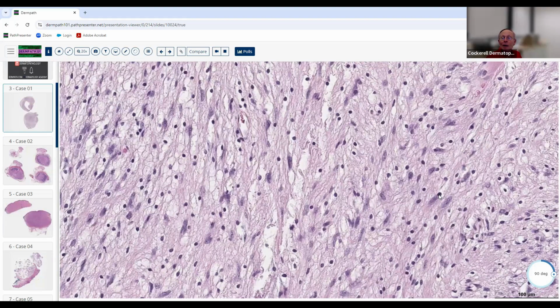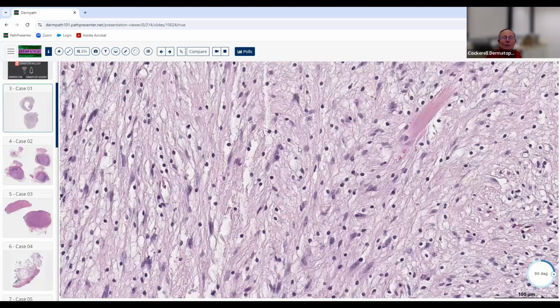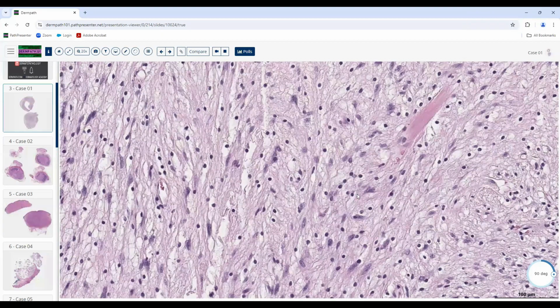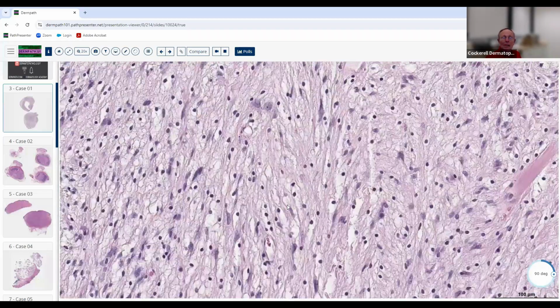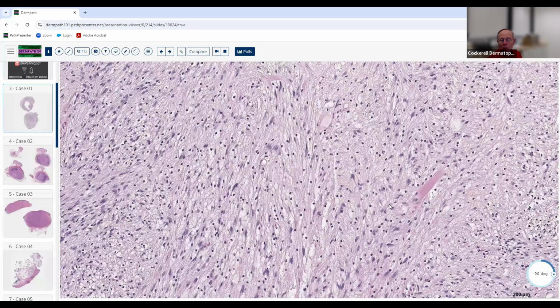Like maybe that, possibly, or see if I can find. Mast, I think you said it. Yeah, say it again. Mast cells. Yeah, mast cells. Good. Mast cells love mucin.